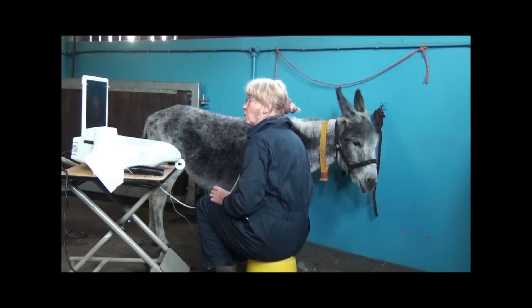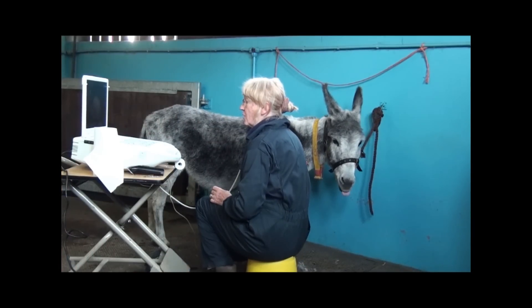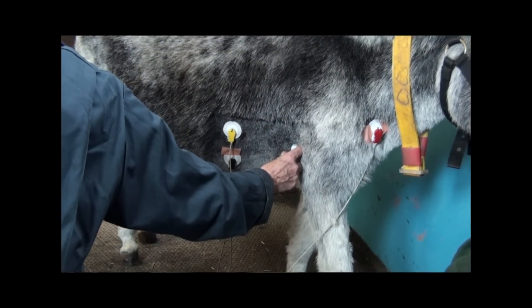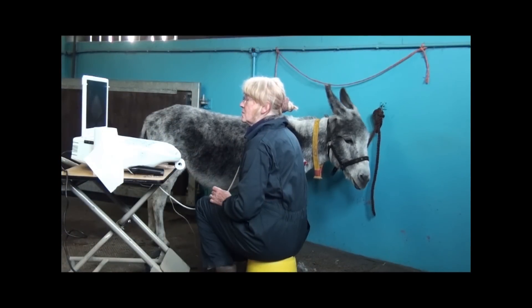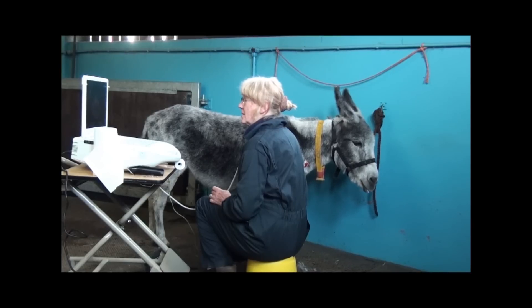What I'm doing is carrying out what we call an echocardiogram, which is an ultrasound examination of the heart, to see how big the chambers of the heart are and to determine how vigorous the heart is in terms of beating and relaxing.